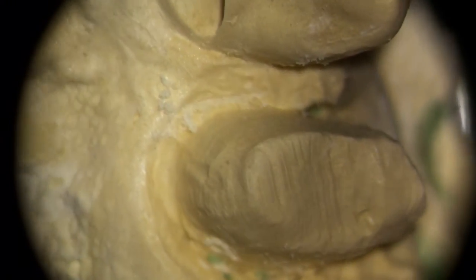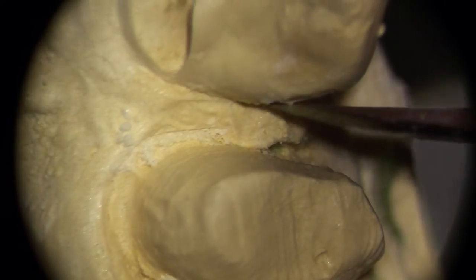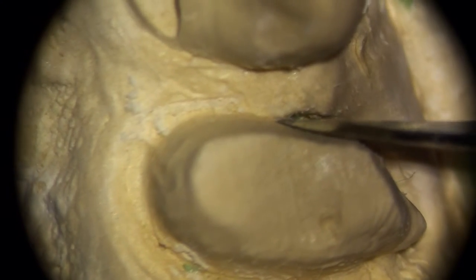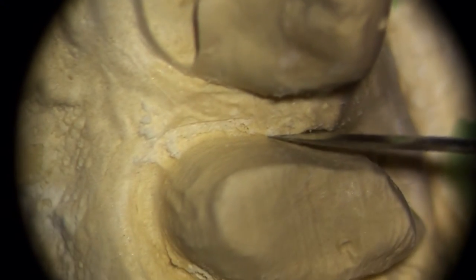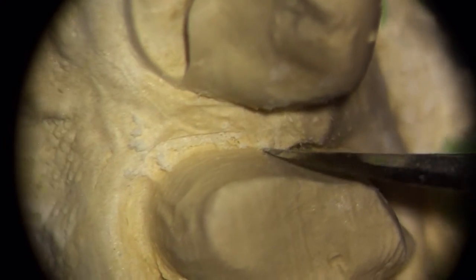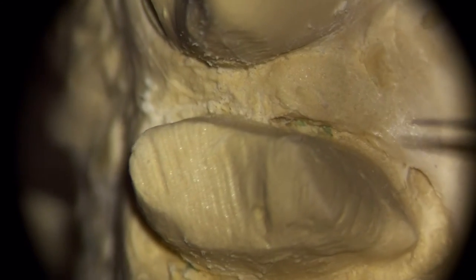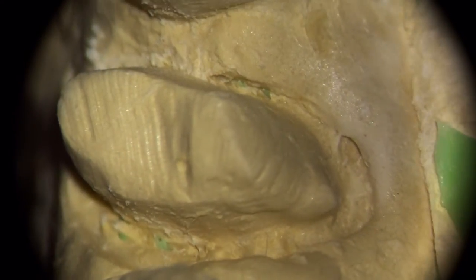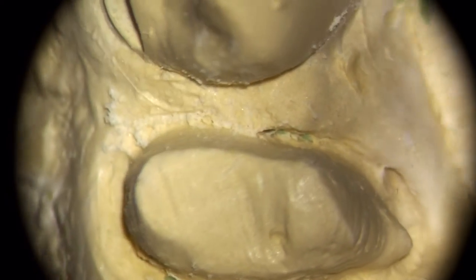Get over here to this other area. And we're going to have to try to guess where the gums are, maybe if we're lucky. The impression material underneath that, and it'll chip away. Nice thing about working under high magnification is we can see all kinds of stuff that you don't get to see without it. Bad part is you got really limited range, focal distance there, so it's hard to see more than one tiny little spot at a time.